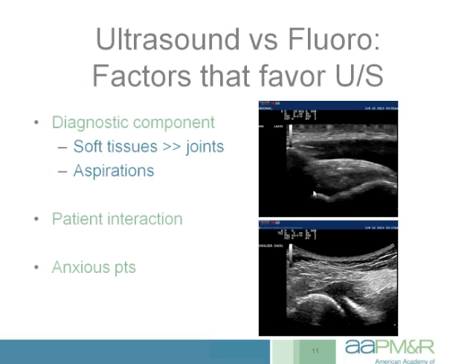So this is the acromion here. This is the humerus. This is basically in a coronal plane over the top of the shoulder joint. So this is the skin, subcutaneous tissue, and deltoid muscle here. And this is their bursal sac, the more superficial layer here, the deeper layer. And you can actually see the bursal line across here. And if this is an area of the body you're used to looking at, you quickly appreciate this is about twice as thick as you would expect it to be.